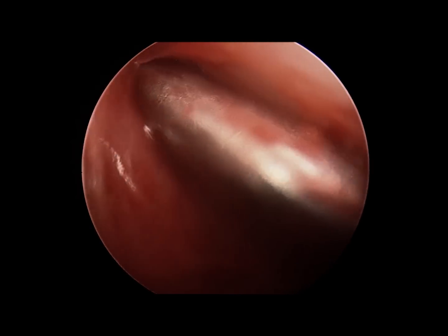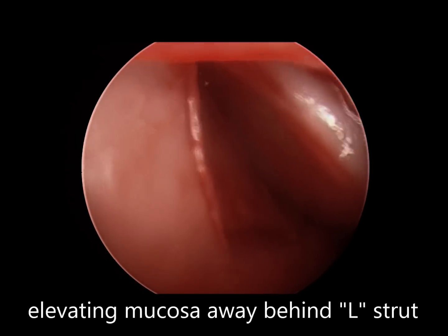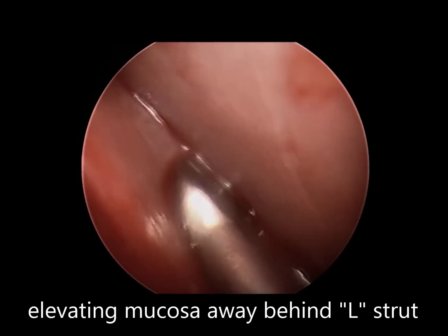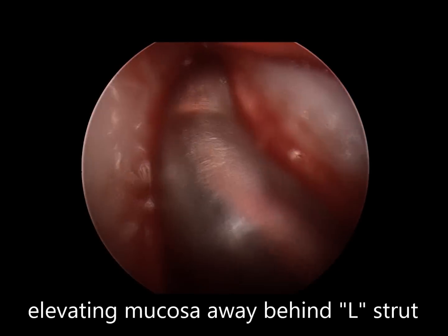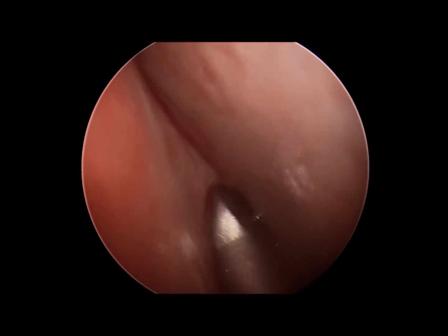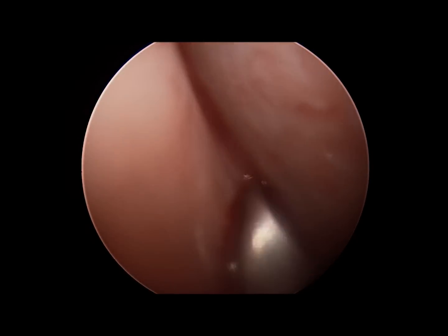And here we have an endoscopic view of elevating the mucosa off of the opposite side from where we had been raising the mucosa, so as to isolate the cartilage behind the L strut, so we will be able to remove this tissue, which is typically deflected, and as well better expose the bone beyond it.